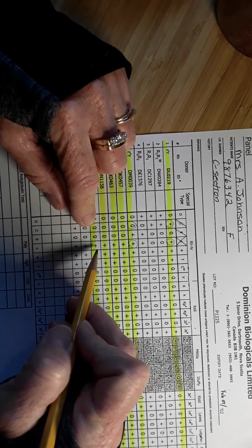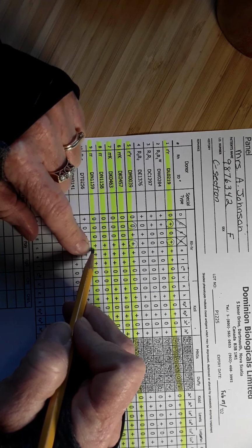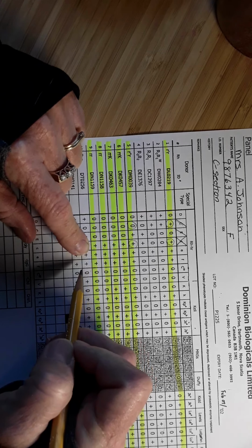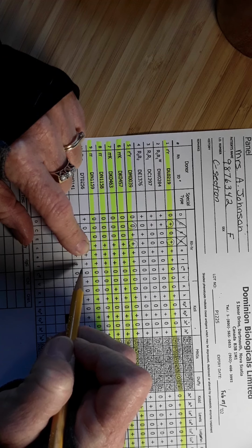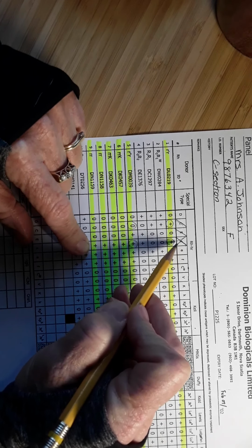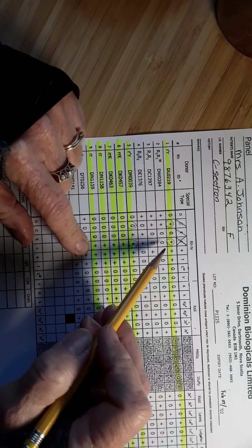What are the chances that your patient's plasma contains an anti-little c that would not react with the strongest representation of the little c antigen? Unlikely. Okay, so that's why I have a double cross on the little c. I found at least 2 cells that did not react.